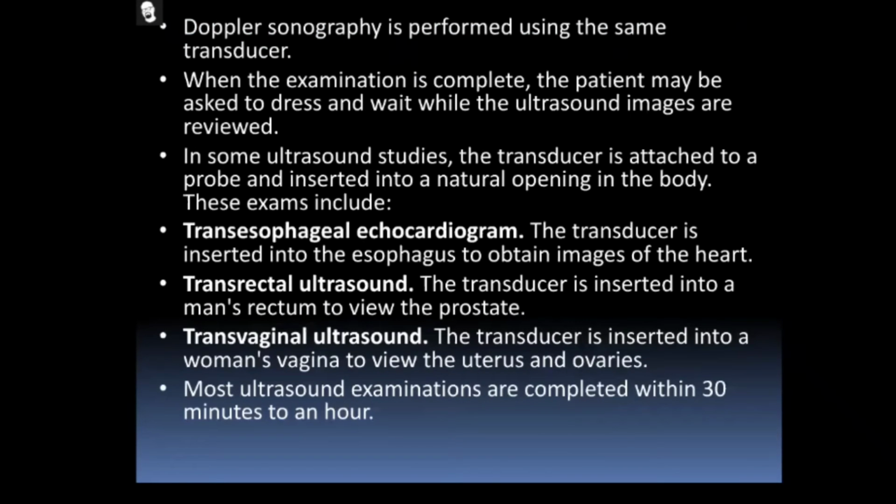And Doppler sonography is performed using the same transducer. The same transducer is used for Doppler and color Doppler, everything. When the examination is complete, the patient may be asked to dress and wait while the ultrasound images are reviewed.